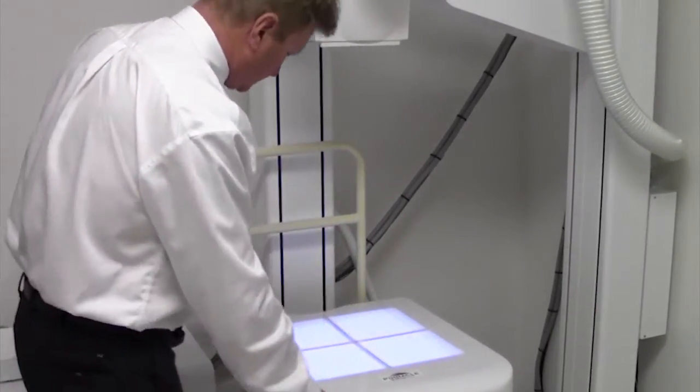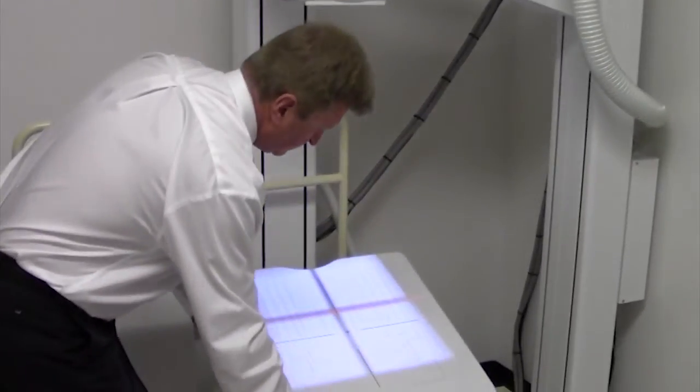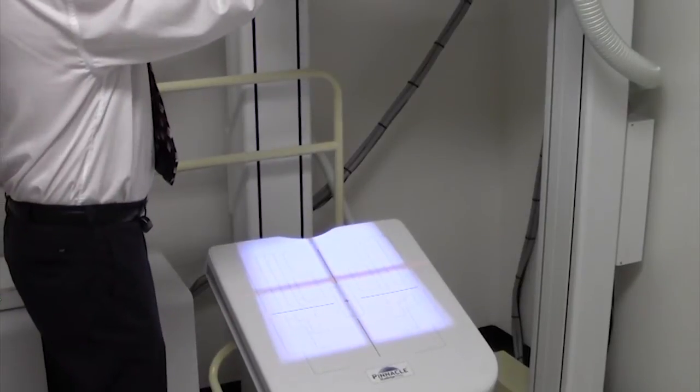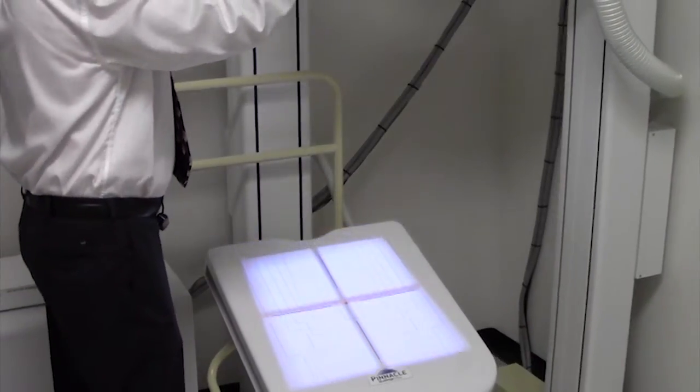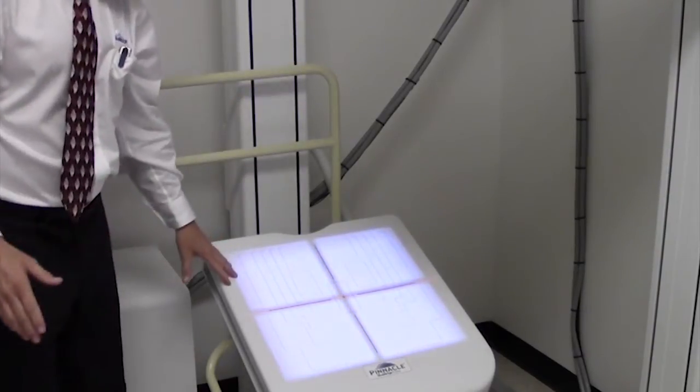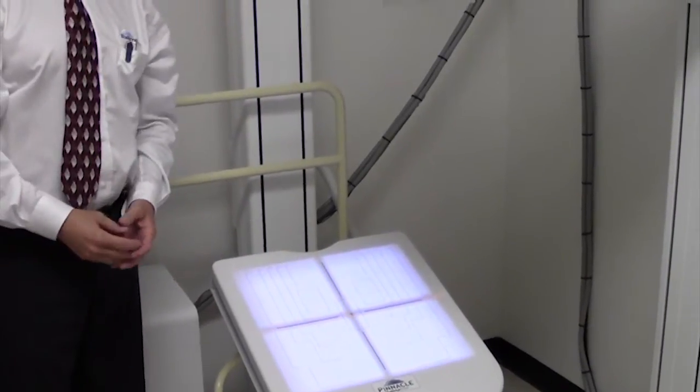For feet, you would have a patient seated, you would angle the wall stand the appropriate amount, depending on the patient, then you would rotate the tube stand independent from the wall stand to achieve the proper positioning.